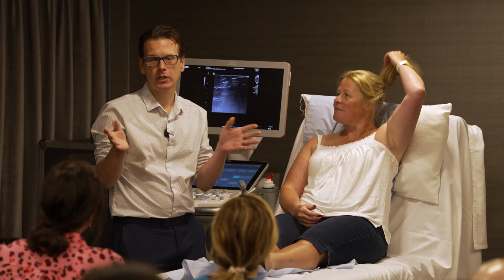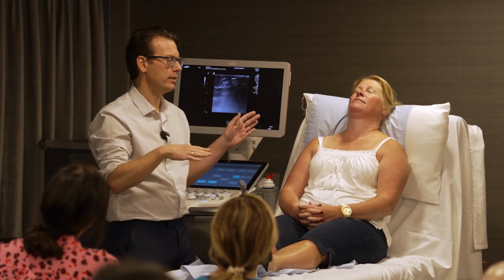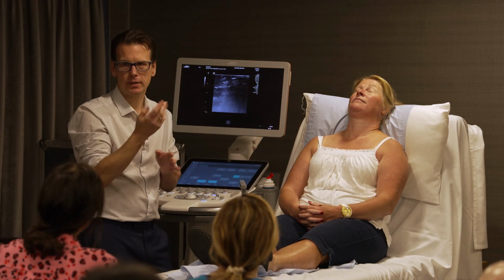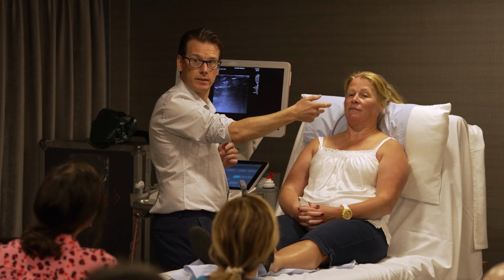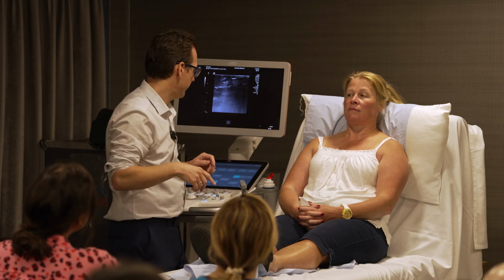People do different things. I've got a colleague who lies people completely flat to do the scan. I like to have them at a 45-degree angle, more or less, just because that's what I'm comfortable with. And then I have them at about shoulder height for scanning. I tend to stand to scan anyway. Some people sit down.